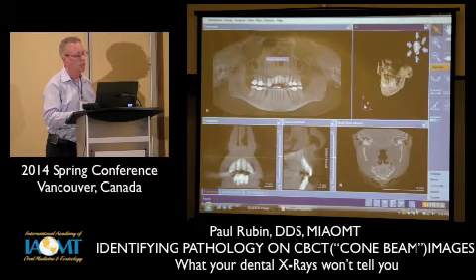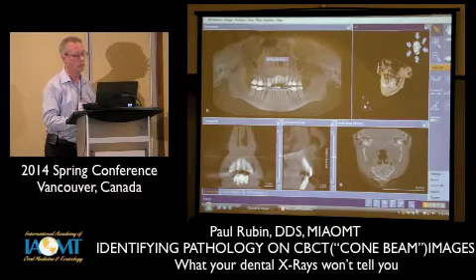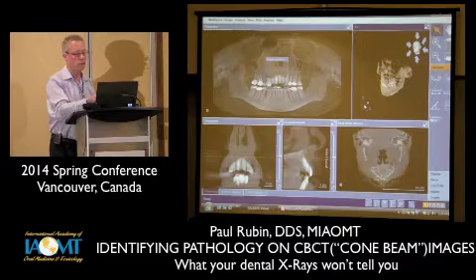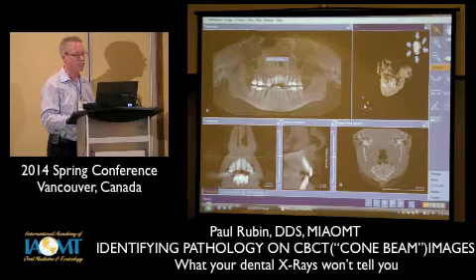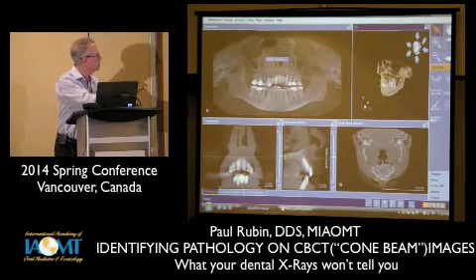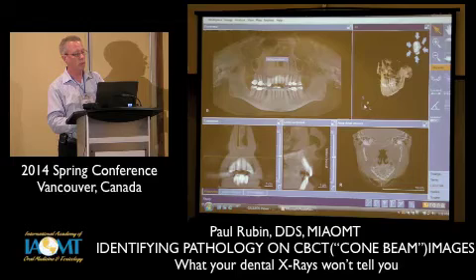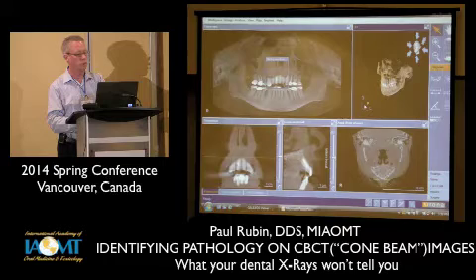On the lower left-hand side is a tangential view, as if you're looking straight on at the patient. And on the middle lower there, you're looking at a cross-sectional view of the same spot that you're looking at on the tangential view. And on the lower right, you're looking at an axial view as if looked from above, at the same spot that these other views are. On this panoramic view, you'll see a little square that says slicing window. This will move any place you want on the image, and you're looking at a narrow piece of this image showing on the screens below.